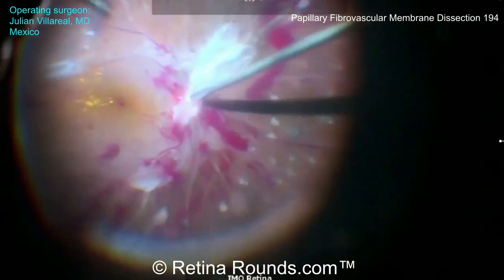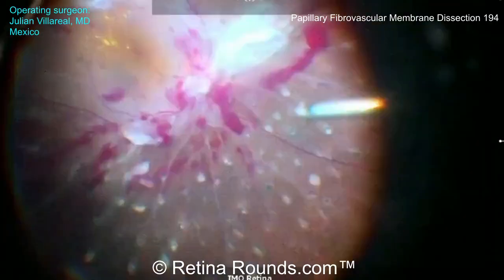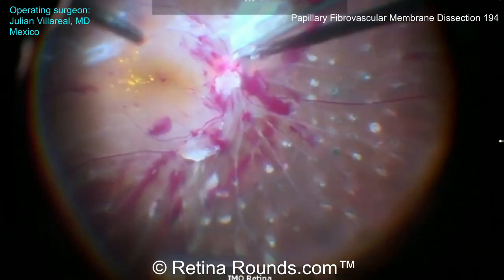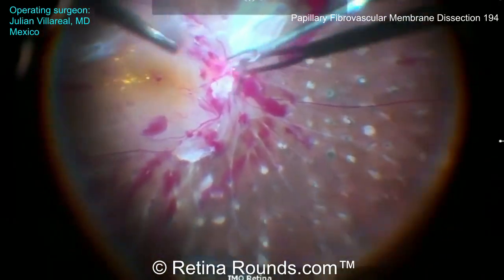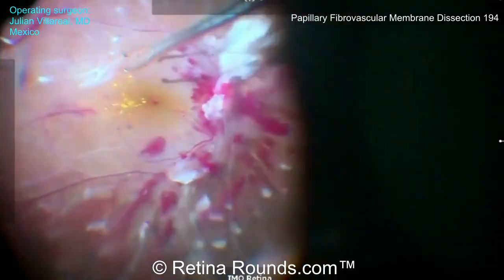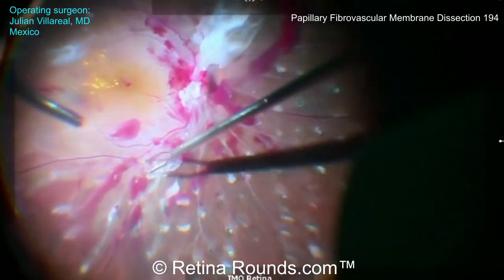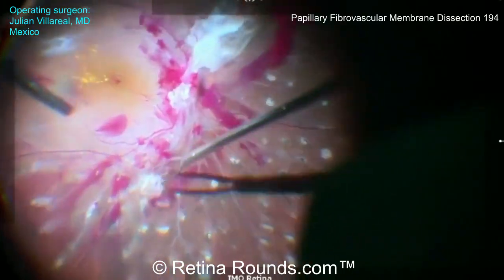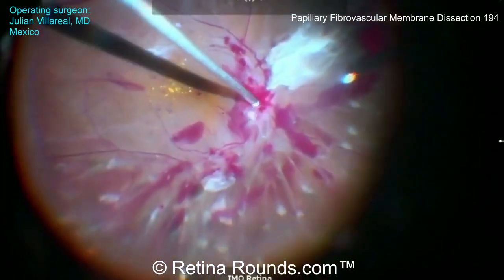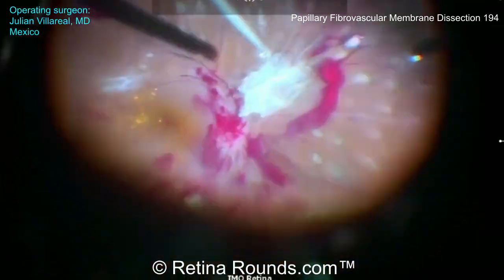You can see during this case that Dr. Villareal is using forceps, but he's not using them to pull up on the membranes to delaminate them over the nerve. Rather, he's using those forceps to better visualize the dissection planes, and then returns with the cutter for more controlled delamination. He does use the forceps to delaminate some membranes more peripherally, but at least over the optic nerve, he's primarily using the cutter.